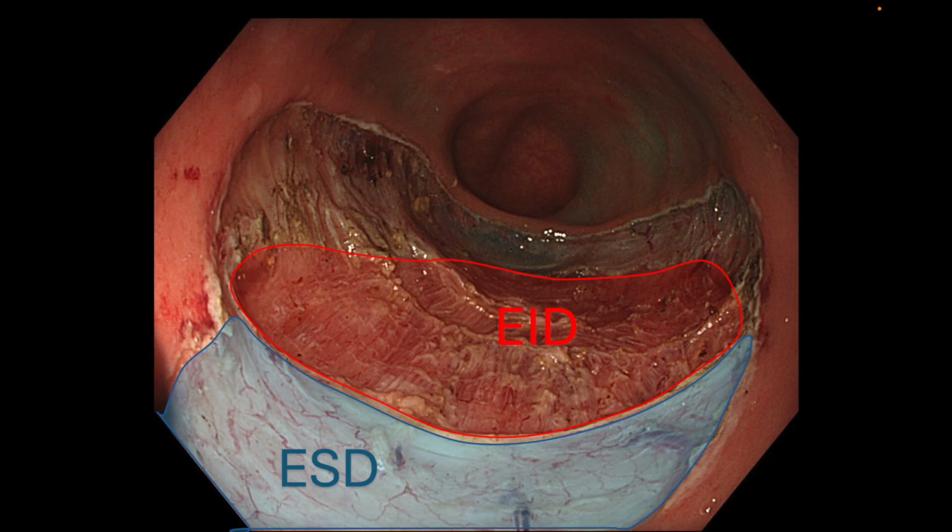Following the Dutch group's recommendations, we usually leave the defect open without closure, and we haven't had any issues with this. The patient then received a short course of prophylactic antibiotics, was admitted for 24 hours observation, and was discharged with no complications.